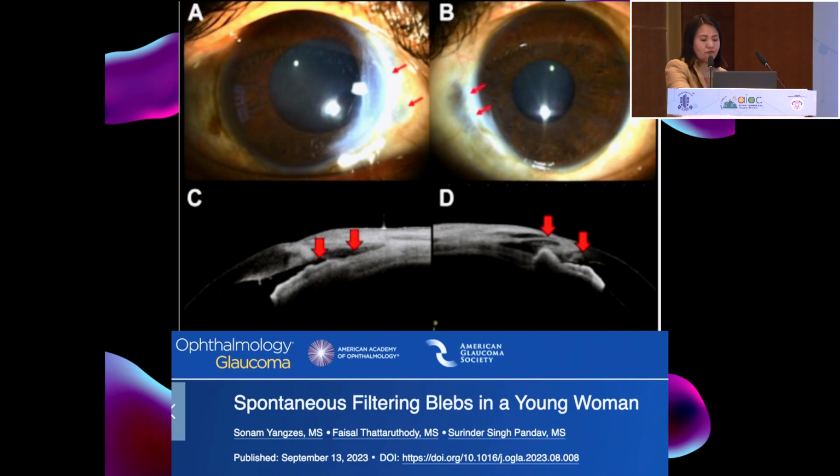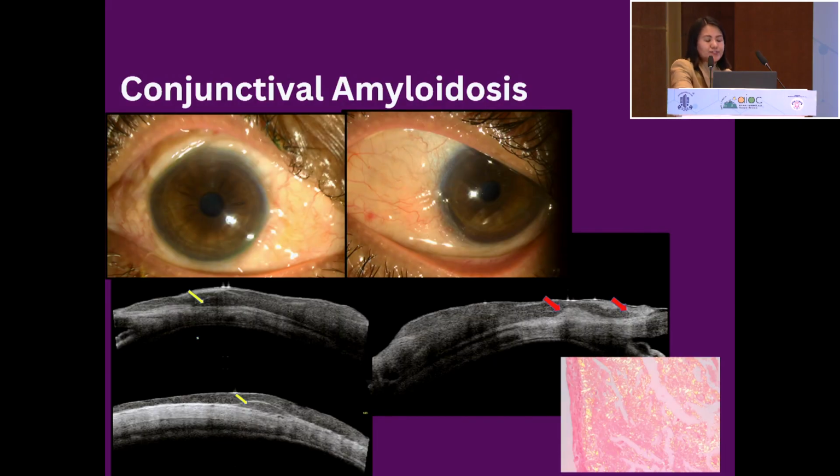This patient, however, did not have that, but yes, we have a good penetration even through the sclera. Another interesting case that we found was a case of a boggy swelling of the conjunctiva, bilateral, who had systemic melanoma, multiple myeloma.